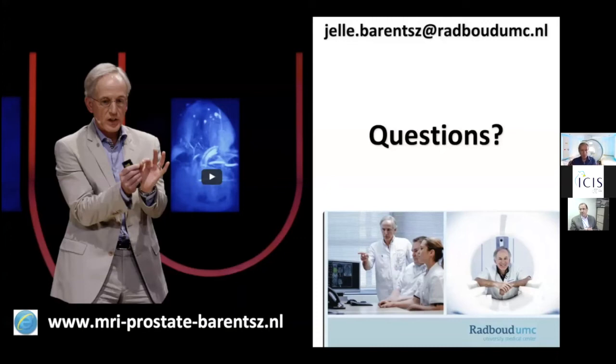So for prostatitis, it may really help. And also cellular BPH, it may be very helpful. So yes, it may help. If you have broad experience in recognizing prostatitis, the use of contrast is a little bit more reduced. I hope that answers the question.